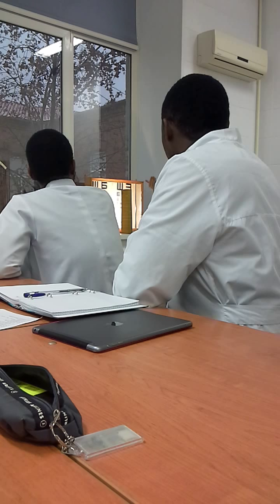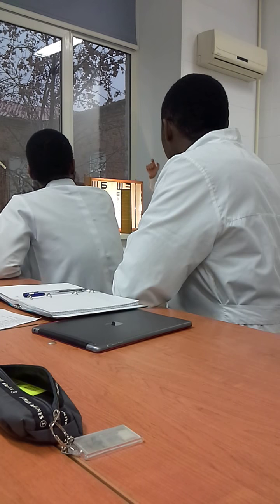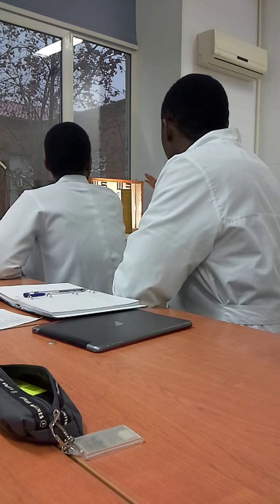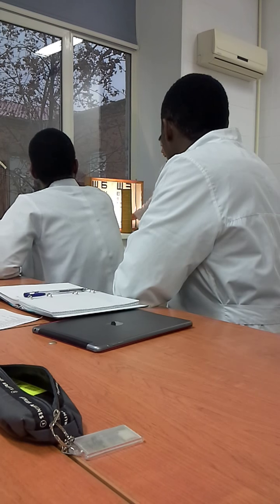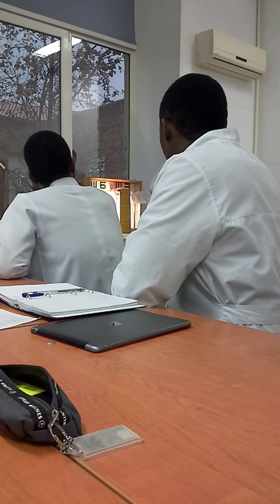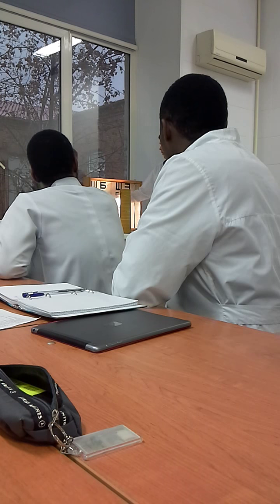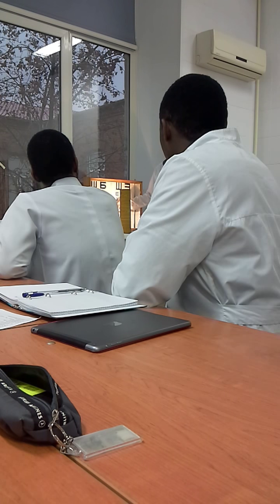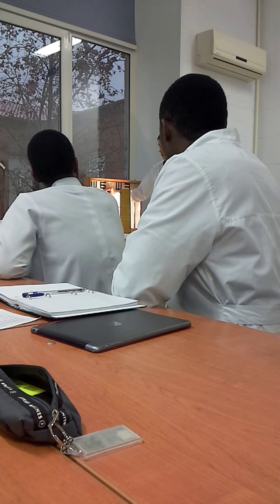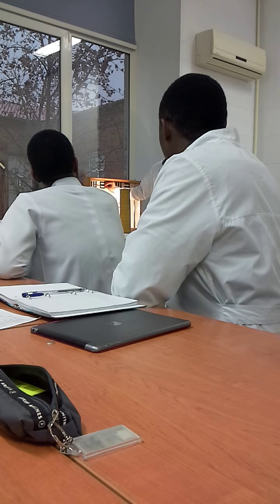The last line the patient can read will determine his visual acuity, provided the number of mistakes does not exceed what is allowable. In the first and second lines, there must be no mistakes at all. For example, if your patient reads the first line correctly but in the second line makes even one mistake — for instance, reads M and E instead of M and K — we do not use that line. The visual acuity will be 0.1, not more.